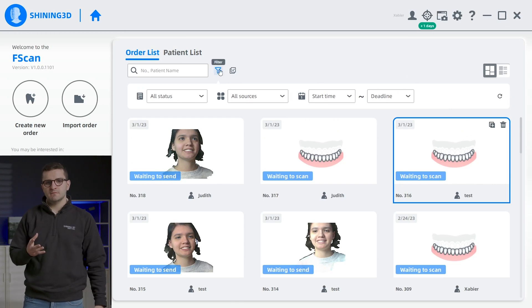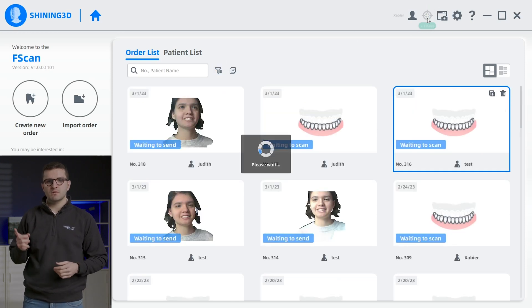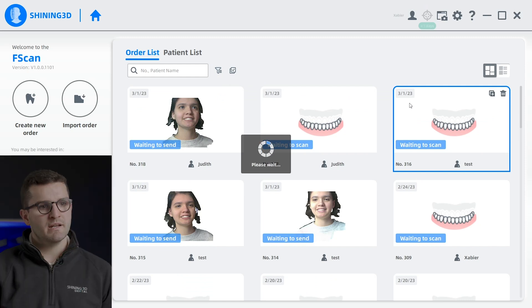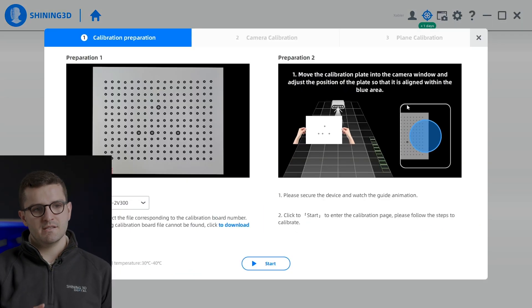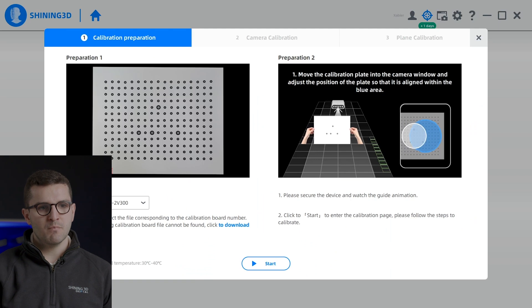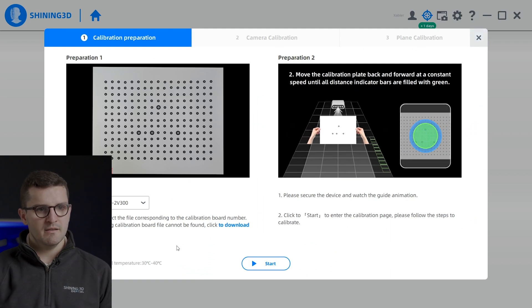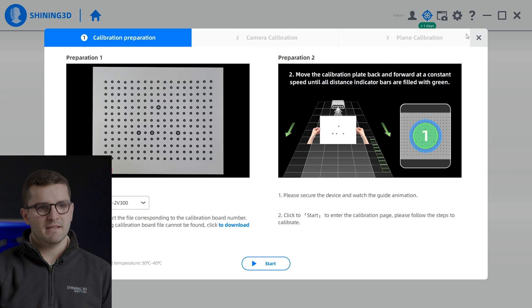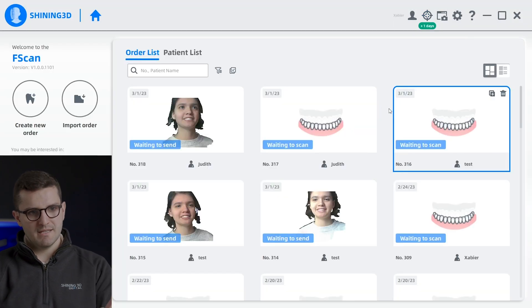The calibration button is located in the upper right corner and it will turn red when a new calibration is required. We understand how important it is to have a well calibrated scanner, and that's why we have made the calibration process for MediSmile both easy and precise.